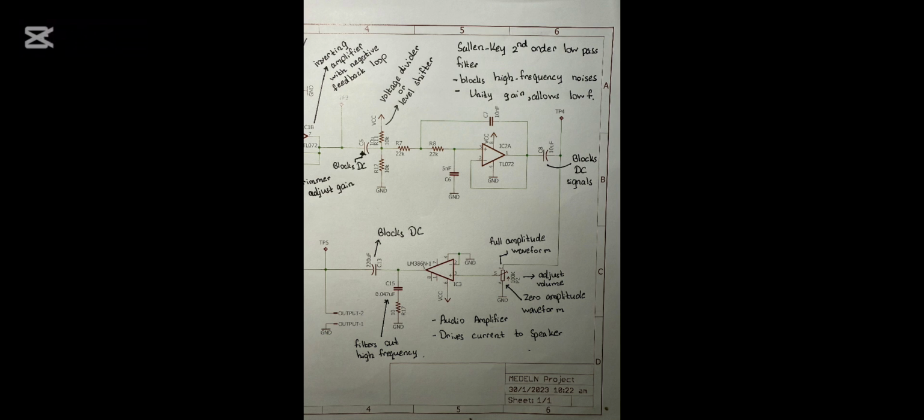The capacitor C15 filters out the high frequency that is above 40 kHz. And the capacitor C13 blocks out DC signals, allowing AC signal to pass through. So the waveform will enter the trimmer P2, where pin E has the full amplitude of the waveform and pin A has 0 amplitude. So we can get an output voltage of 7.2 volts. We can adjust the volume of the speaker by adjusting the trimmer P2.